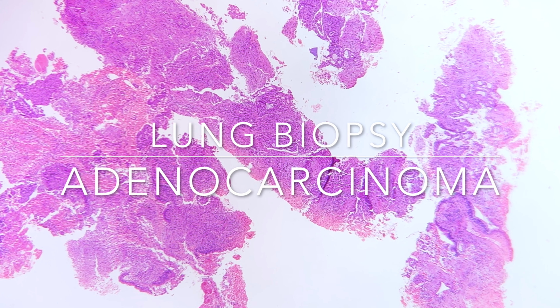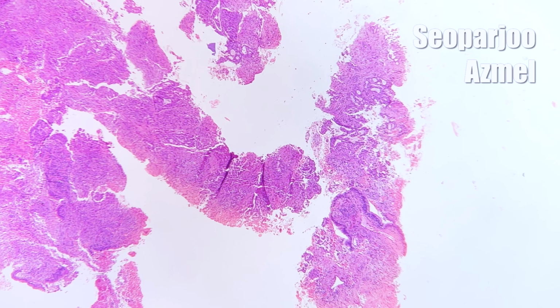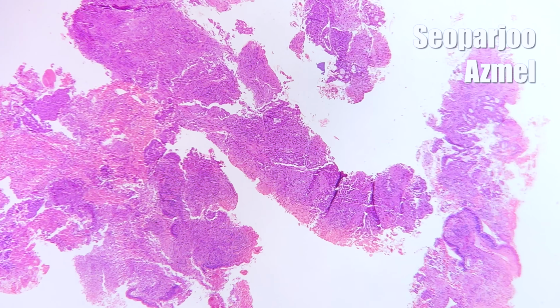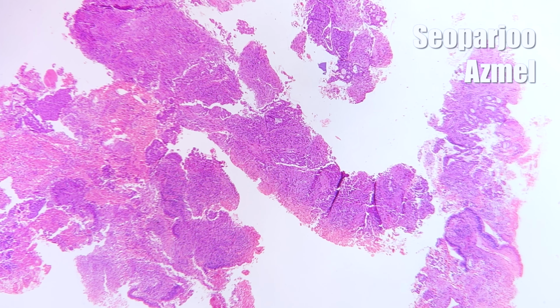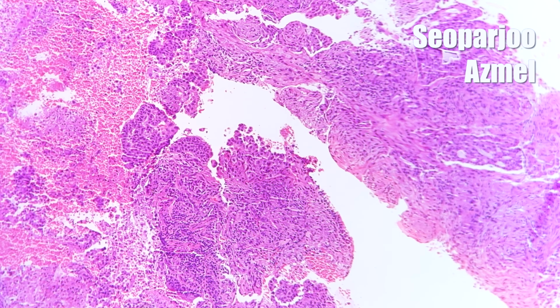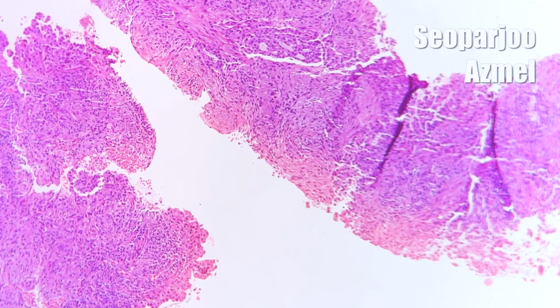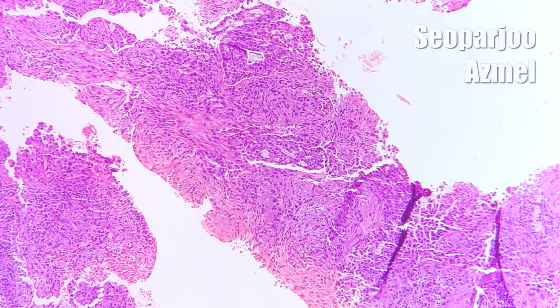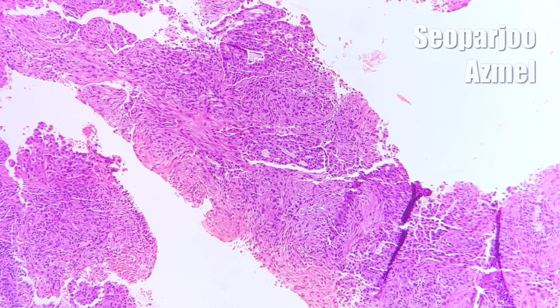This is a lung biopsy, which consists of a few strips of cells or a few strips of tissue. You can see this tissue is very busy with cells. If you take a closer look, there are some cells arranged in cords and also clusters. For example, at the center over here, you can see some cells forming a gland or tubular-like structure.